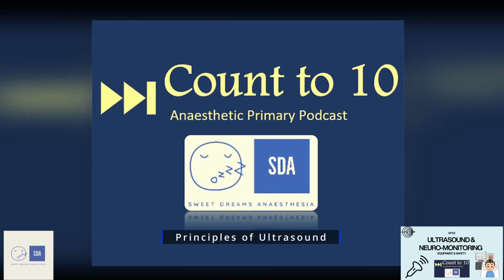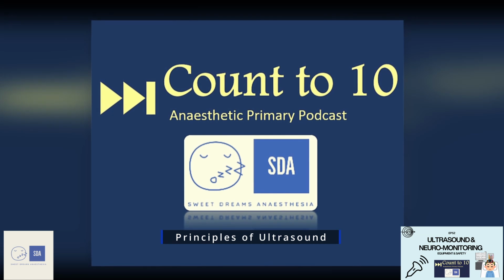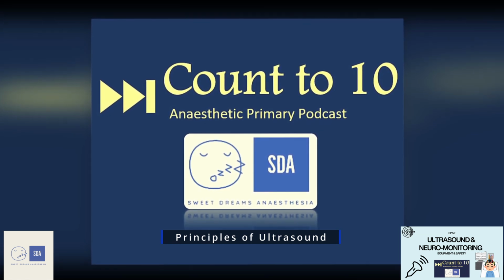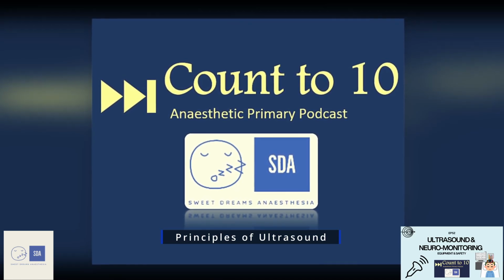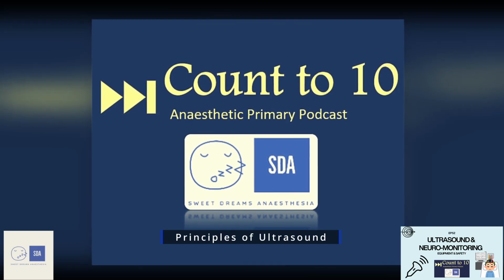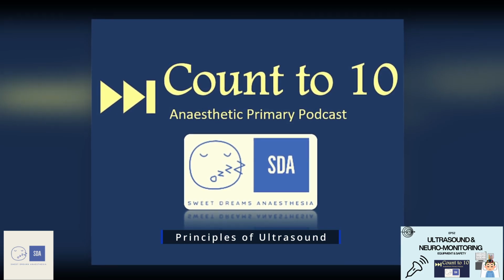So when you think about attenuation, think about it as the concept of the ultrasound wave losing energy, but also it is important because it provides reflection, and without reflection, we would have no ability to generate an image. This then leads us on to talking about how the ultrasound actually makes the image that you see on the screen. And for this, you have to recognize that the ultrasound can only detect a few variables.